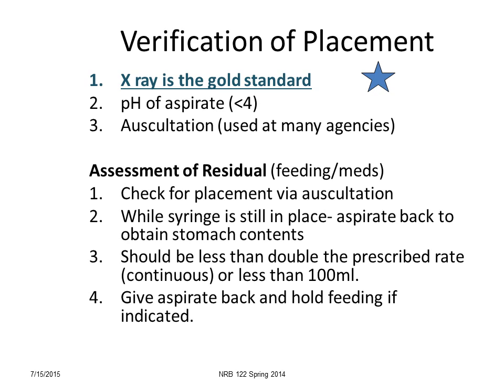And the tubes are radiopaque, which means that they're visible on the x-ray, and it's going to show us very clearly if it's in the stomach. Think about why this is so important. If this tube was inadvertently placed in the lung, we would kill our patient. We would drown the patient with the fluid.